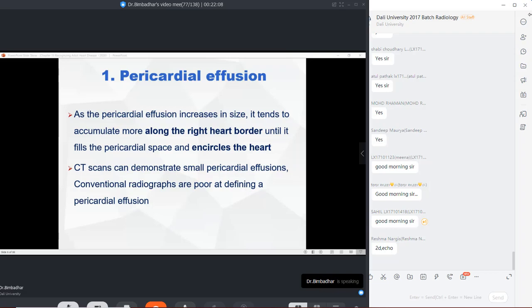But if I'm going to look at the chamber conditions, at the blood vessel situations, and at the complete extension into the mediastinal spaces, you see there will be a lot of exploration that has to be done on a 2D echo. It is difficult because not everybody can handle an ultrasound machine. Echocardiography and ultrasonography interpretations are generally preferred as a bedside diagnosis.